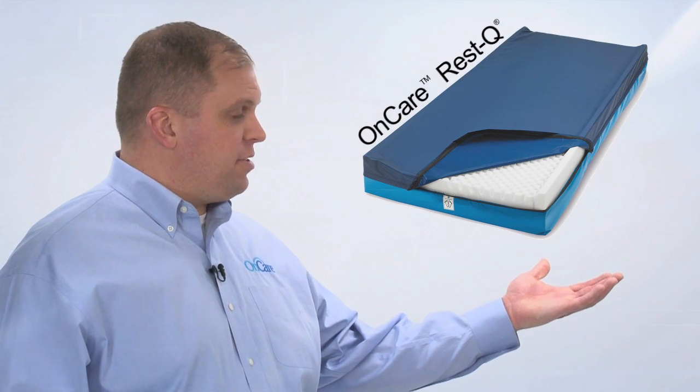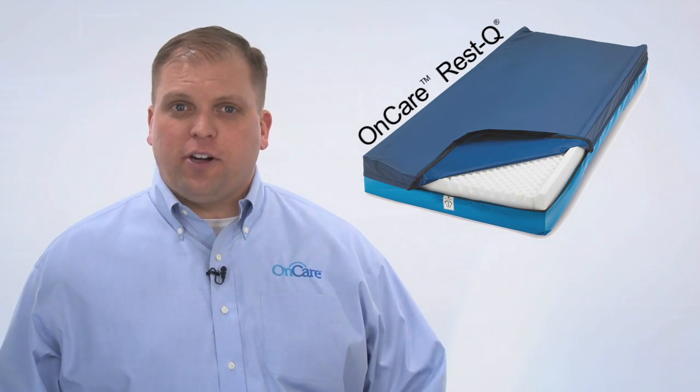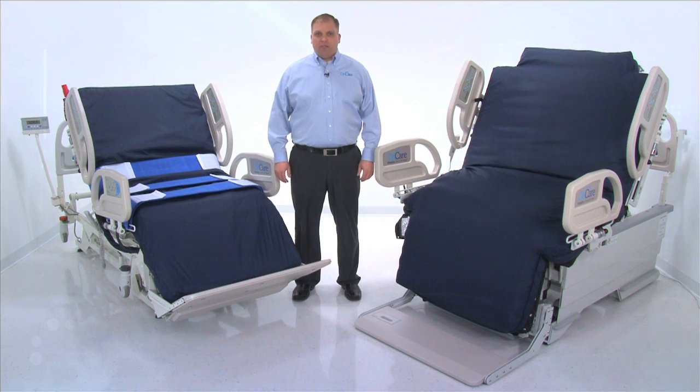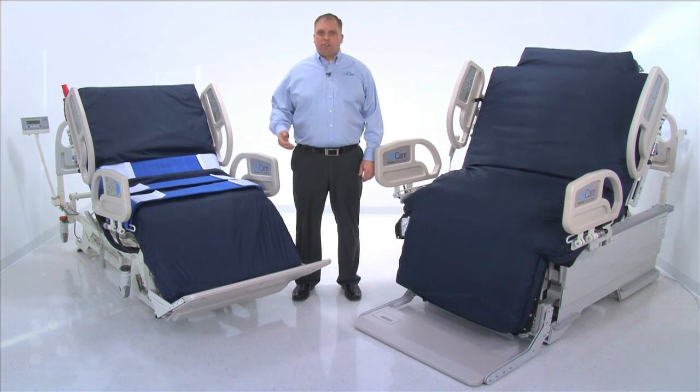The width and length of the bariatric air mattress are expandable to accommodate a variety of patients and can be collapsed to help make narrow doorways easier to navigate during transport. The clinically proven OnCare Rest-Q mattress is available as an alternative pressure redistribution foam surface. For the benefit of cardiac therapy, physical therapy, and patient comfort, the Total Lift Bed features a cardiac chair position that does not require footboard removal.